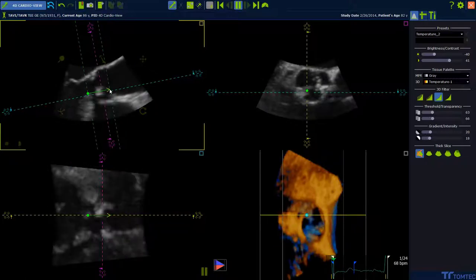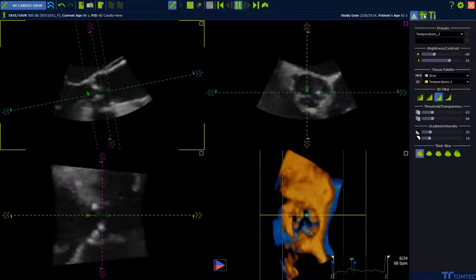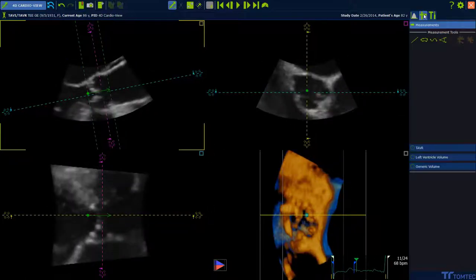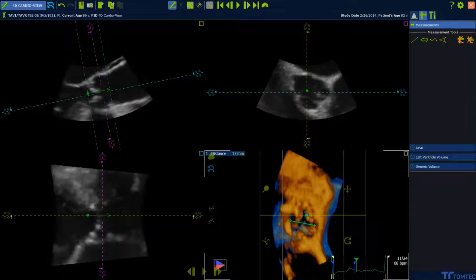You can also measure. Simply click on the measurement tab and select a measurement. Use the left mouse button to set the measurement. The measurement will be displayed in the left upper corner.